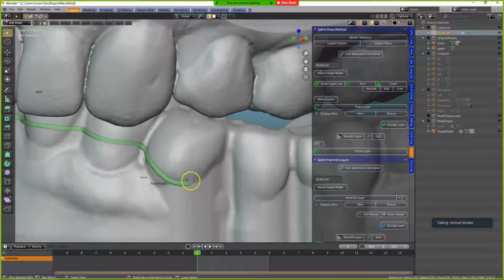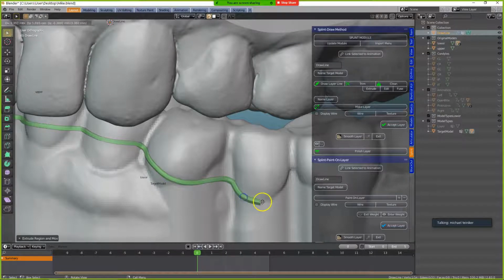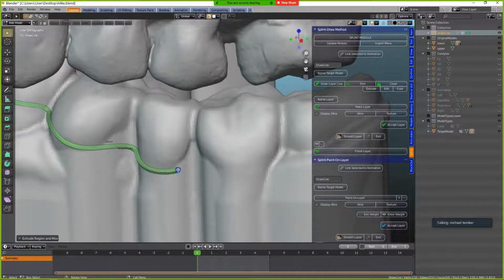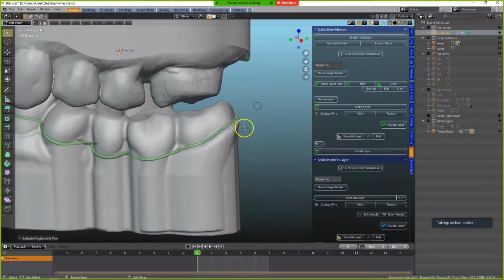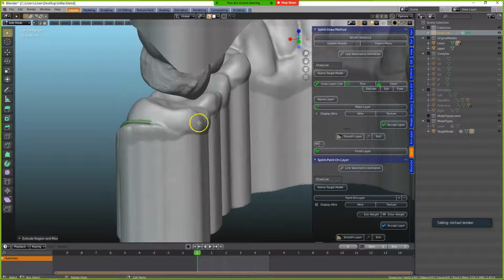So if I take it up top here, we're not engaging the undercut, which means anytime we don't engage, it's going to be loose. Okay. So I'm going to try and engage the undercut like that. And we're going to take this over all the way.